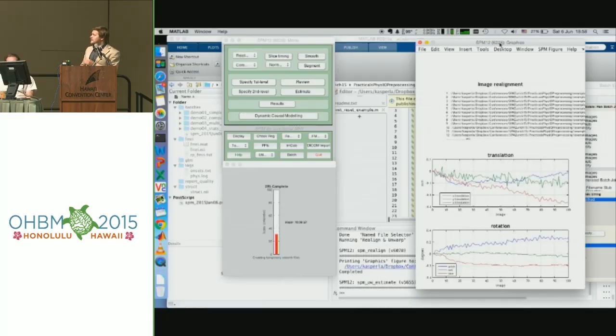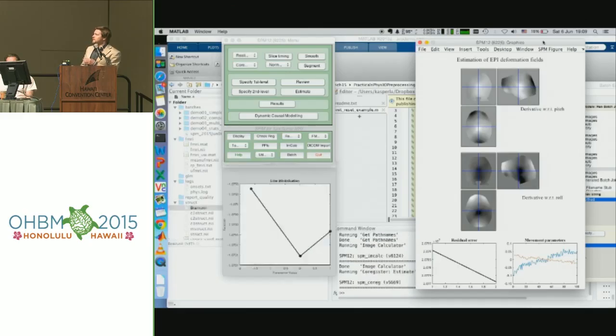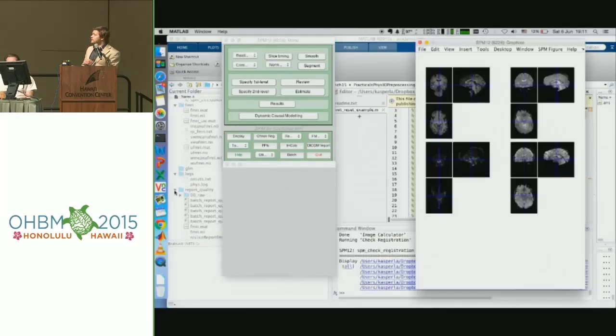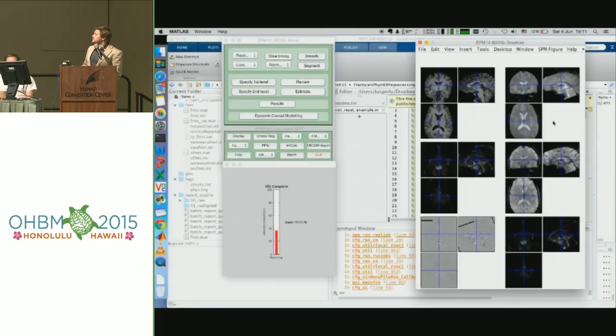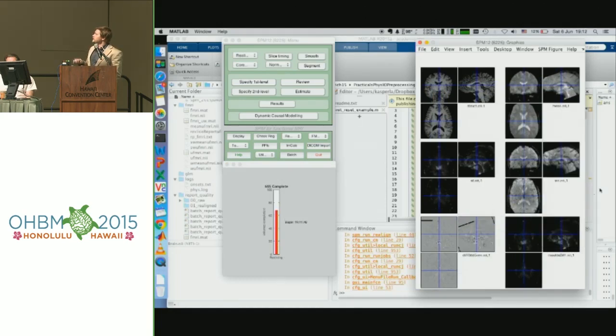Yeah, let's now run it sped up. It would probably take another 10 minutes to run this. The same things happen as before. That's really not very interesting. But in the very end, you see that these output images are created, and that's using a tool we will look at in a moment. We can zoom in a bit. You see the mean image here. You see the SNR image here. You can even display the file names to see what image you actually display here.